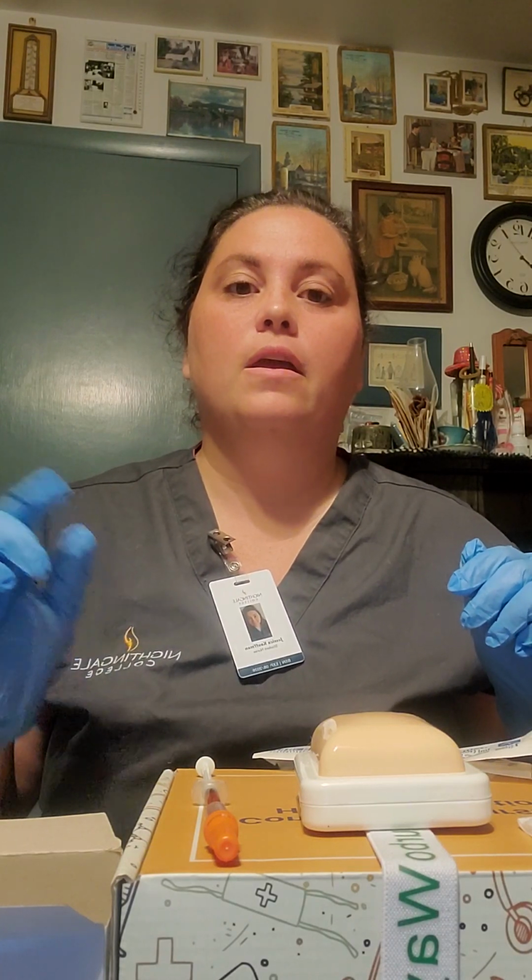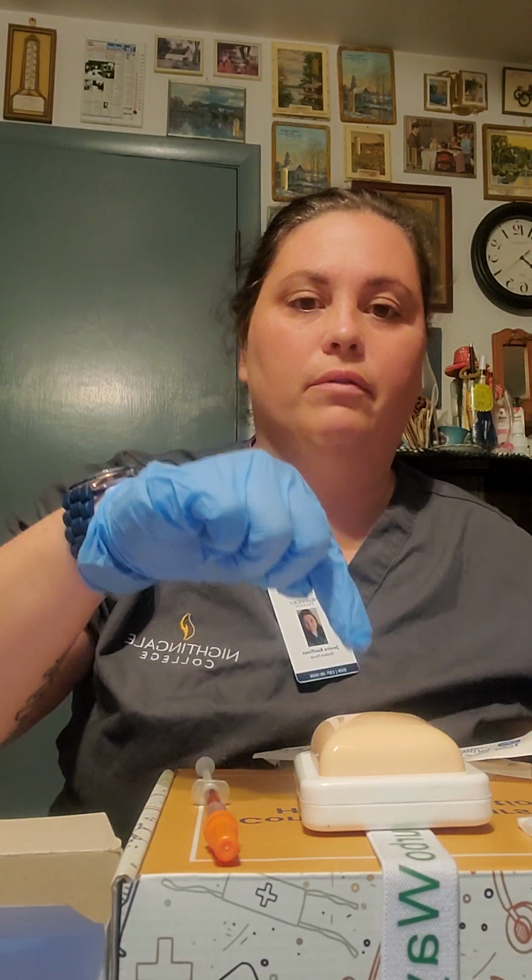Okay, so subcutaneous injections can be in the upper arm, in the abdomen, across from the umbilicus, and also in the thigh. So for this injection, I'm going to go on either side of the umbilicus. I'm going to pick the right side, which is going to be right here where my pad is.